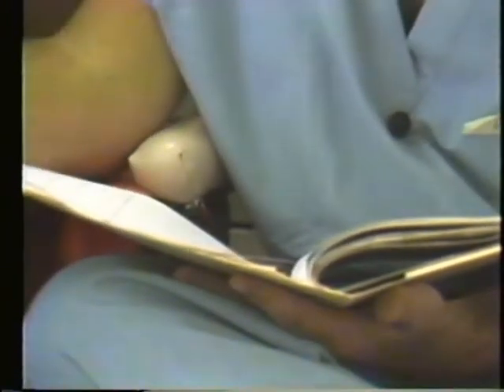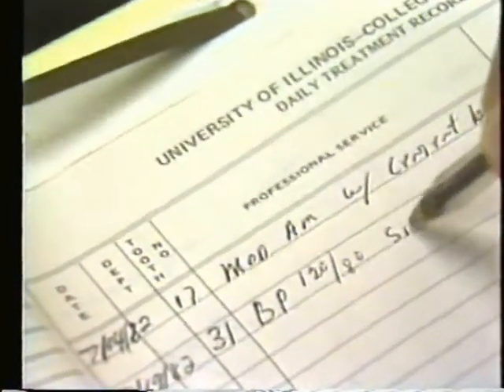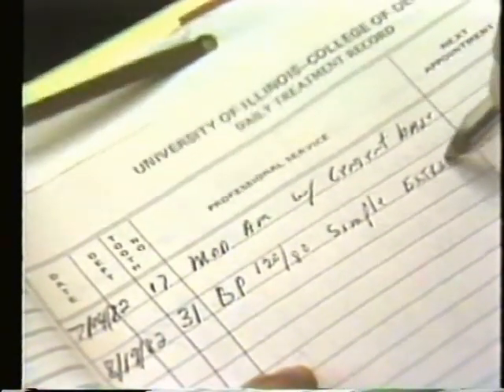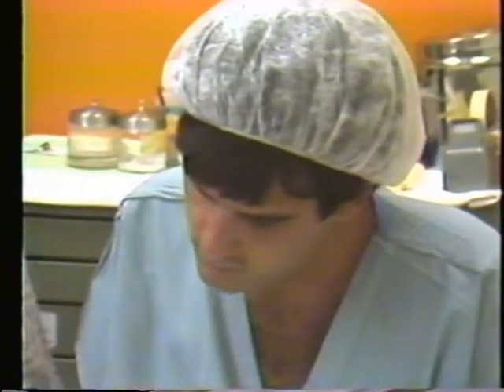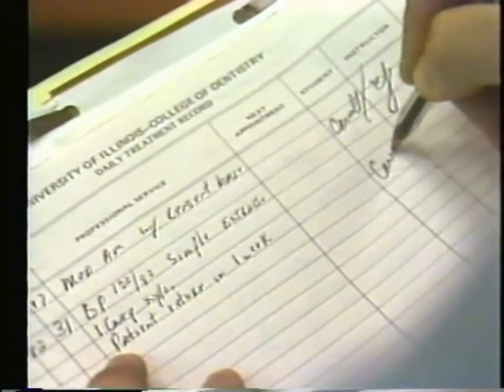Record the completed procedure in the chart. Clearly, but briefly, describe the procedure you performed. Indicate any complications which occurred during the procedure. If your patient requires no further care in the oral surgery facility, indicate in the chart that the patient is complete in oral surgery. If your patient is to return for further treatment or for postoperative observation, record this and the date of the next appointment. Sign the chart and have it countersigned by the faculty member who has been supervising the case.